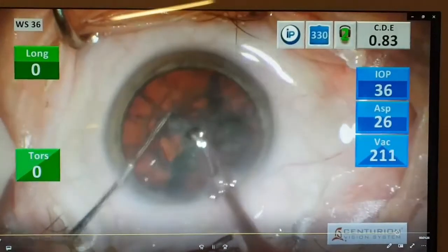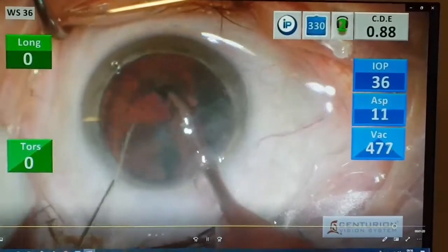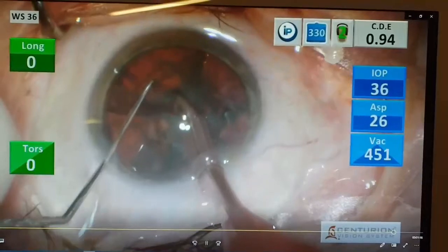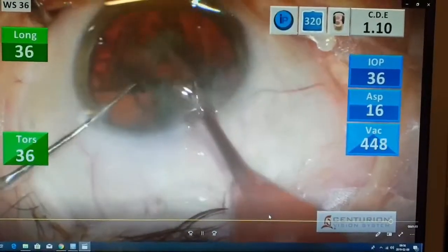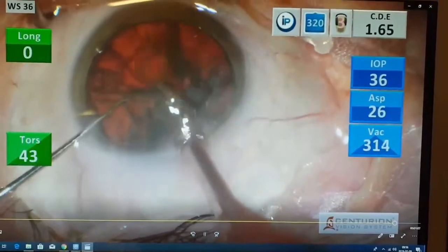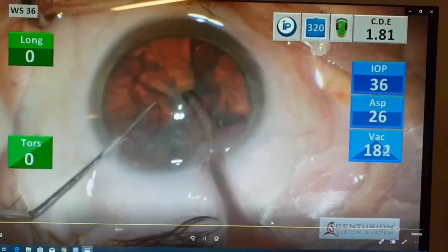This will result in direct cracking, and we complete that with the lateral separation in situ as described by Dr. Vasavada. Multiple fragments will help us to reduce the Phaco time. At the same time, it will give us better stability and less damage to the endothelial cells.